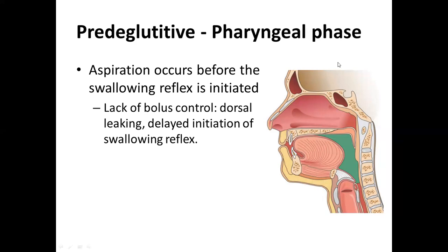We can appreciate contrast media covering the oropharynx at this level, and the epiglottis has closed the larynx here, and the contrast goes down to the esophagus. At this level, if there is incompetence in closing of the larynx, definitely we'll have aspiration taking place.